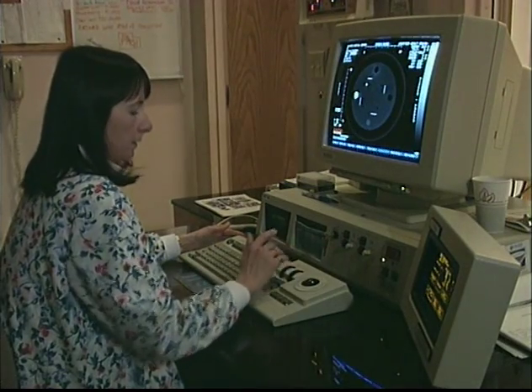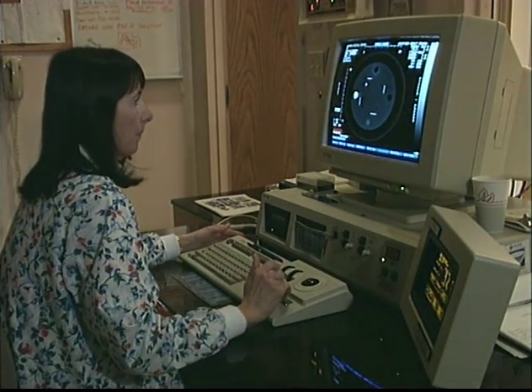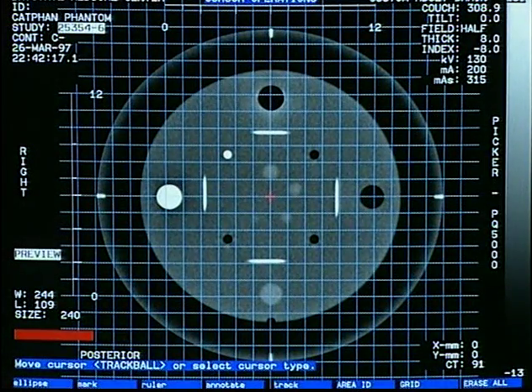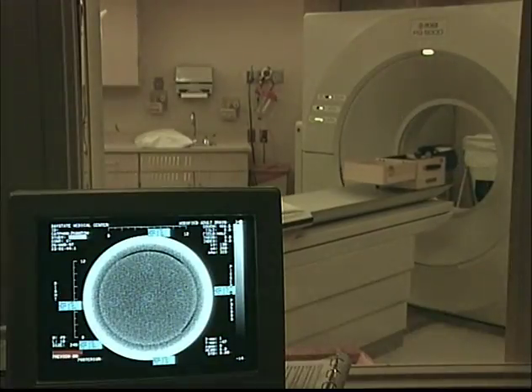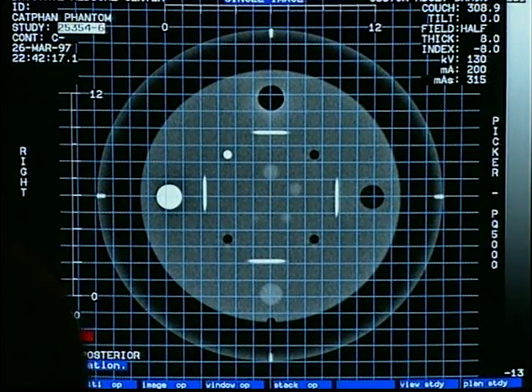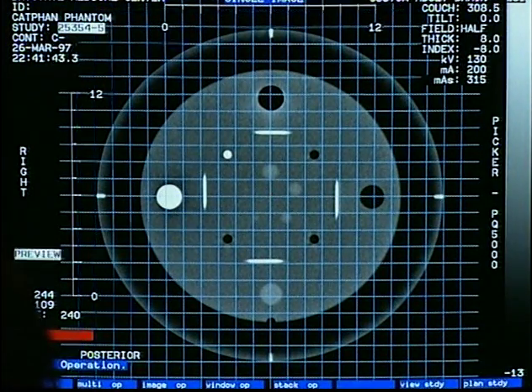Verify the X and Y alignment by the Phantom's position in the center of the screen. The scanner's grid selection feature will assist you in viewing these axes. Incorrect alignment may indicate the need to recalibrate the alignment lights or the scout view accuracy. Test these by selecting and scanning the center of the slice section 1. Evaluate the alignment of the wire ramps in these images.